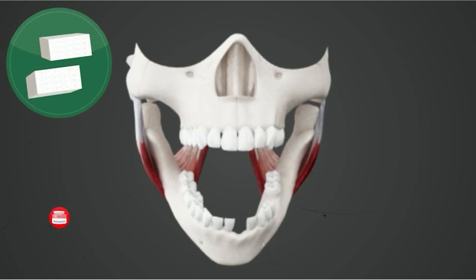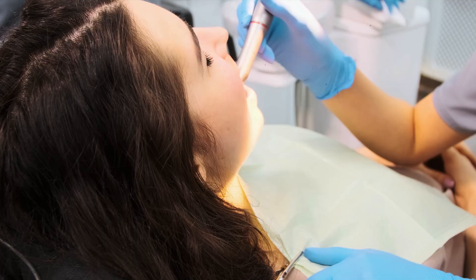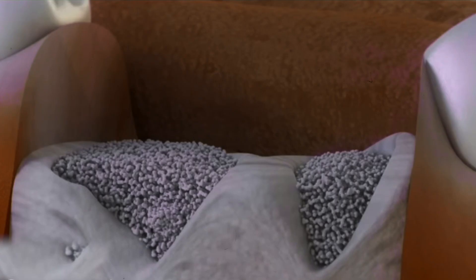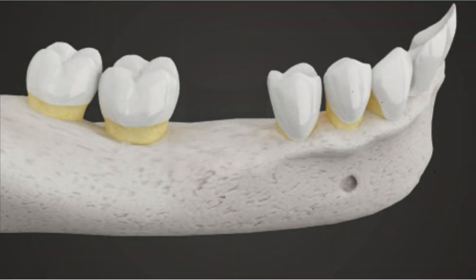The bone used for the graft can come from different sources, such as artificial bone material, a donor, or even from your own body. Depending on what's best for you, the doctor will choose the appropriate type of bone for the graft. After placing the bone, the gums are stitched up, and the grafted bone is left to heal and fuse with the surrounding bone tissues.